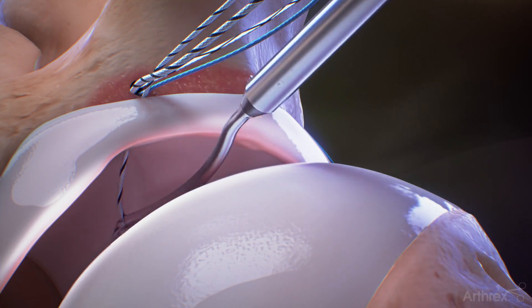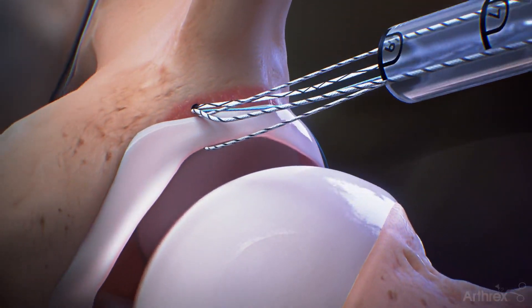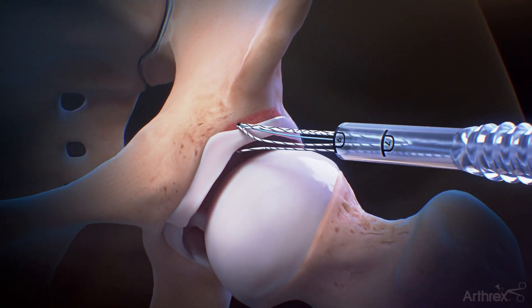Retrieve the looped end of the shuttle suture with the swift stitch and pull it outside of the cannula, removing all slack.